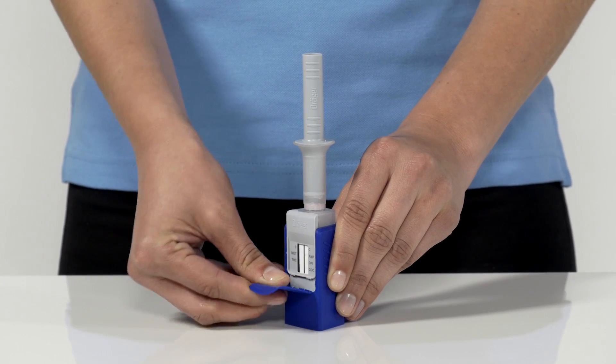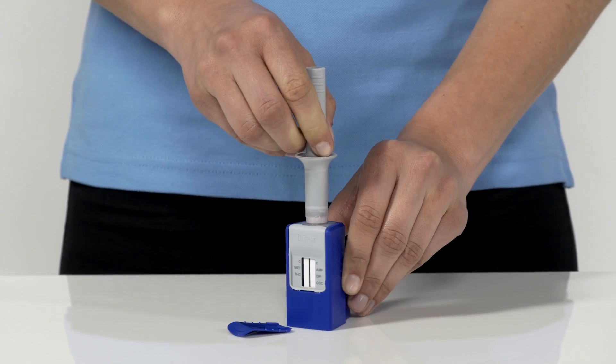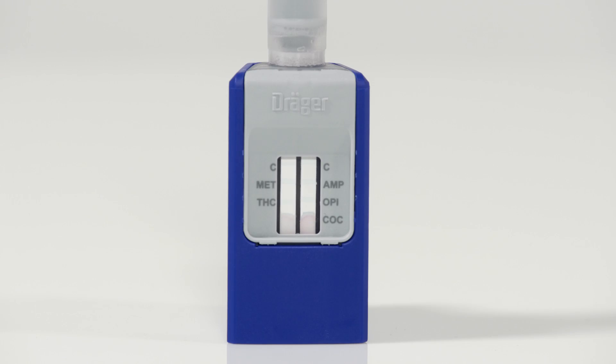After the wait time has passed, pull down the security tab to completely detach it. Then push the sampler straight down into the test kit up to the stop. The test has now begun.